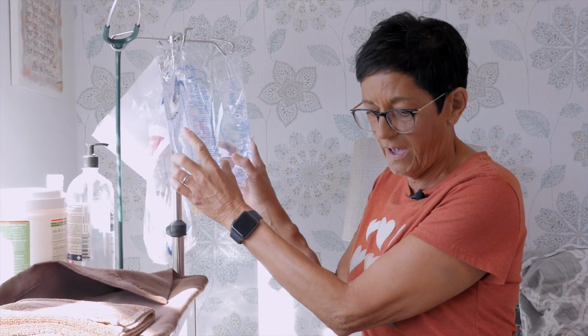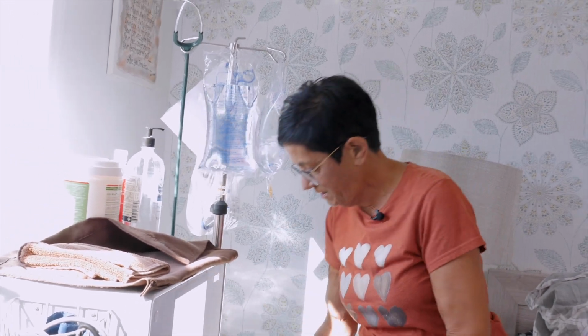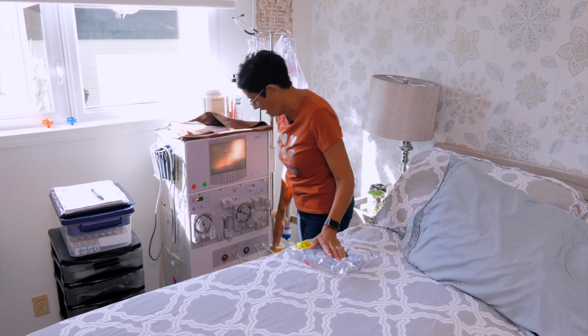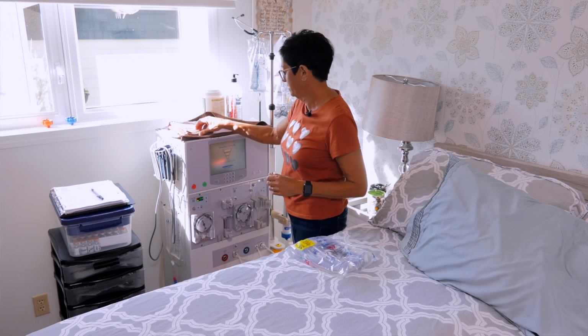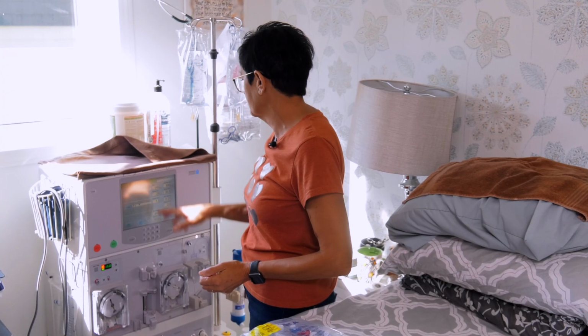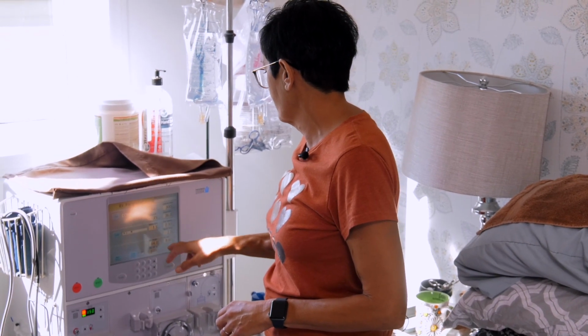Once I'm done treatment, I clean everything, and then from my last treatment, I've already hung my IV bags, my dialyzer or my artificial kidney. I've put out my lines and my drain bag and my acid and my bicarb. I usually do it the night before, and then when I come, there's just a little less to start the treatment with. So then once the machine is on, I check my settings. So you just double check all of that before you confirm it.